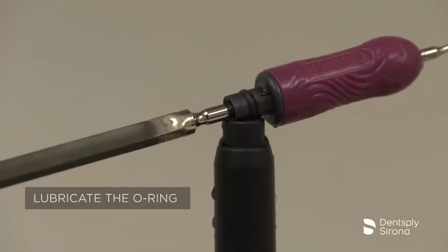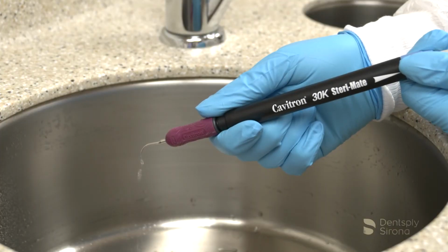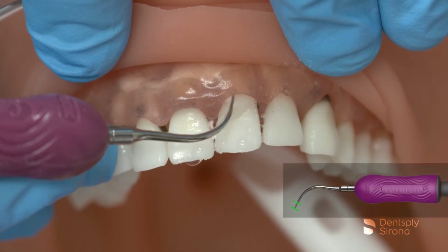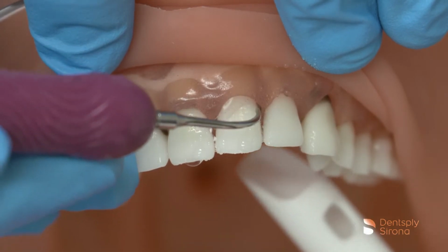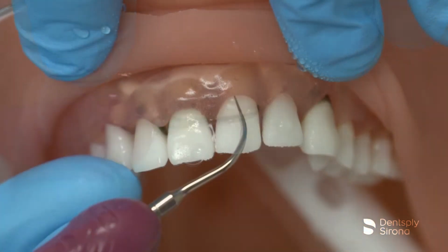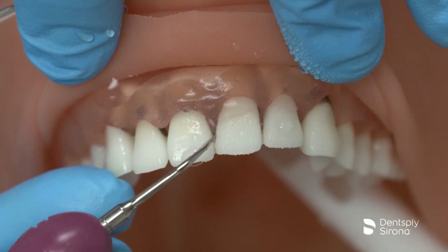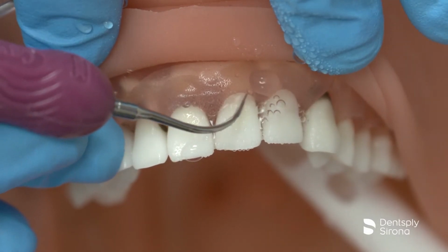After the clinician has filled the handpiece with water, seated the insert, selected the power, and adjusted the spray properly, instrumentation begins according to the treatment plan prescribed for the patient. The clinician will begin on the clinical crown, mindfully adapting 2 to 3 millimeters and angulating the insert no more than 15 degrees to the long axis of the tooth. The strokes are small, 1 to 2 millimeter overlapping to ensure thorough debridement of the biofilm and any light deposits. Due to the ultra-thin diameter of this insert, it is imperative to maintain 2 to 3 millimeters adaptation of the lateral and/or back surfaces of the insert at all times. Once the clinician has approached the line angle, the clinician will adapt more obliquely to allow adaptation under the contact.